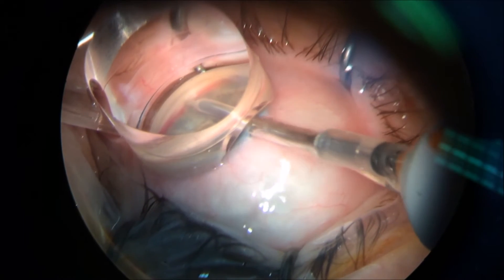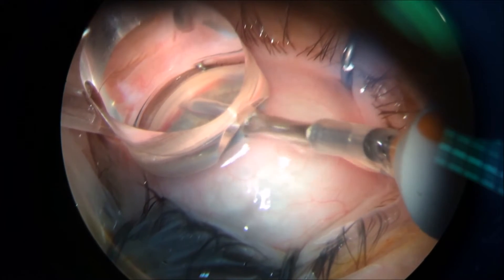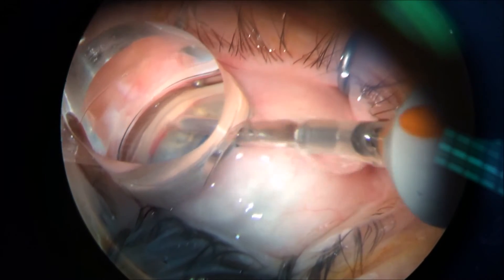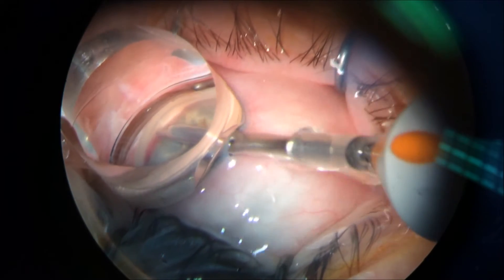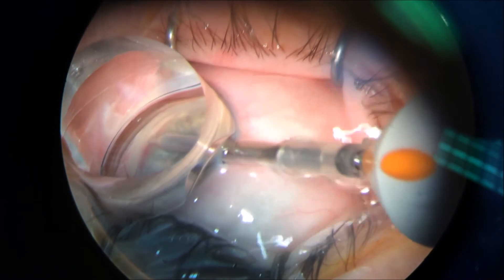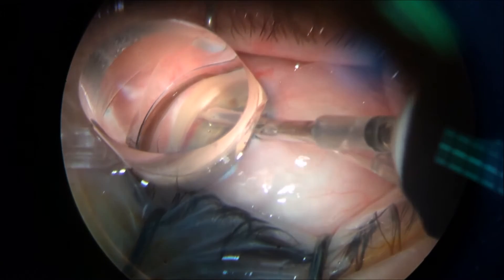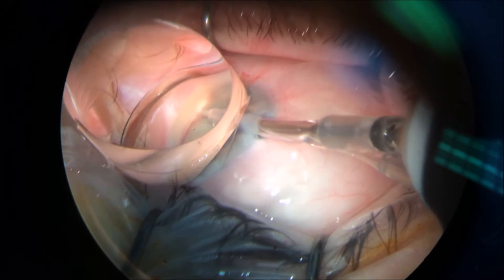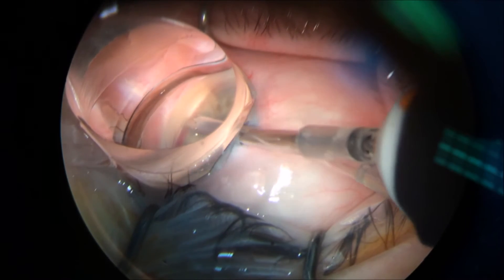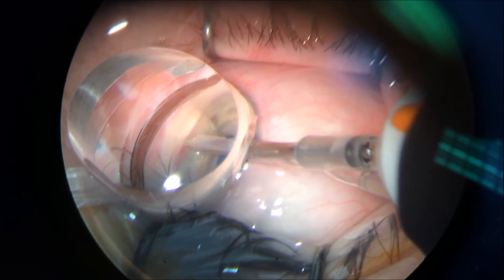Notice the blood reflux that quickly came out through the very small and thin wall of Schlemm's canal. After the procedure was done, the blood in the angle is proof of patency — this procedure actually removes, cleanses, and vacuums the trabecular meshwork without touching the iris and without a peripheral iridectomy.